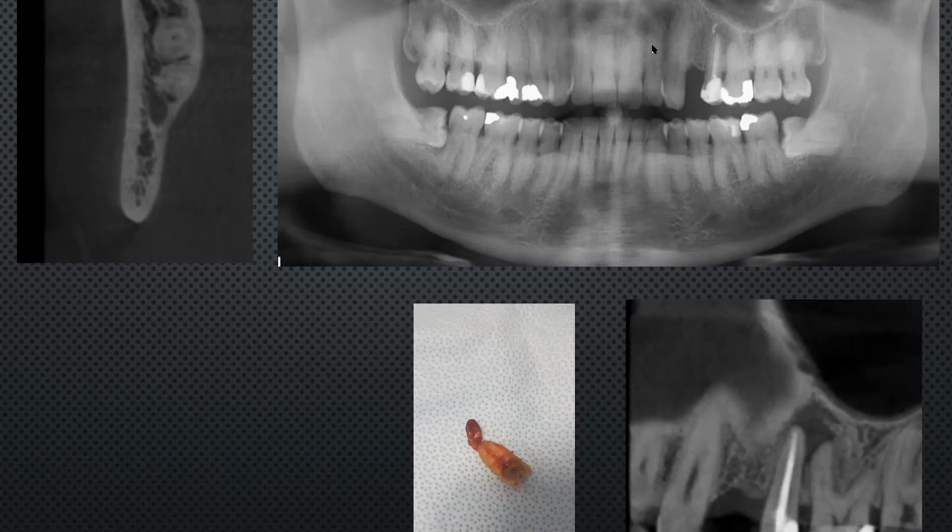Okay. So let's assume that the site isn't grafted at all, because essentially, if you can preserve the papillae on the distal of the canine and on the mesial of the 6, and just do an H flap, so you just do an incision across the ridge, and then just a small incision on either end, like a stop cut, then that's quite nice, because you've got enough access and visibility. You can extend the stop cuts into the buccal sulcus if you want to, but you're preserving the papilla and the attachment on the adjacent teeth. So that's quite nice if you can do that.